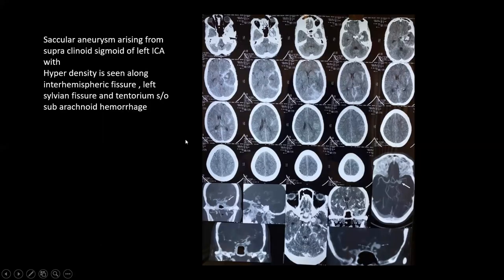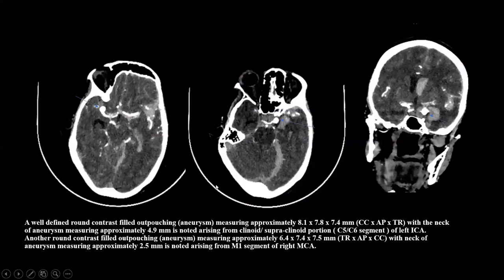In another patient, hyperdensity is seen in the left Sylvian fissure, tentorium cerebelli, and interhemispheric fissure. CT angiography reveals a saccular aneurysm arising from the supraclinoid segment of the left ICA. In yet another patient, a well-defined rounded contrast-filled outpouching is noted arising from the M1 segment of the left MCA, with an additional aneurysm arising from the left ICA also visible on coronal imaging — diagnosed as a fusiform aneurysm.